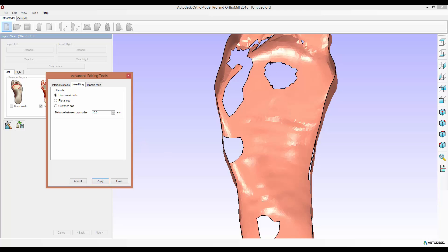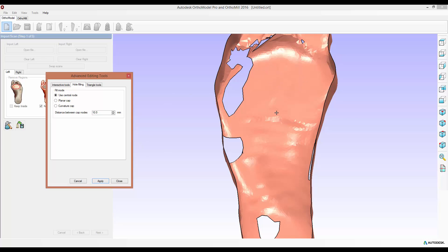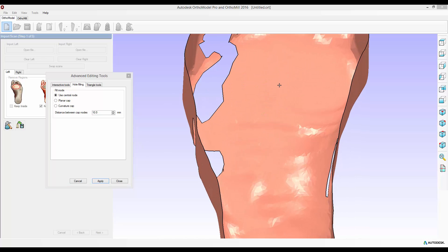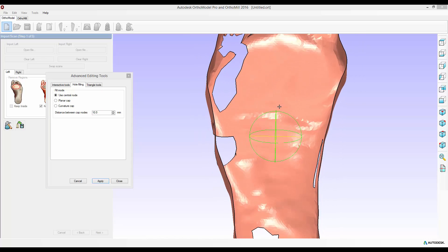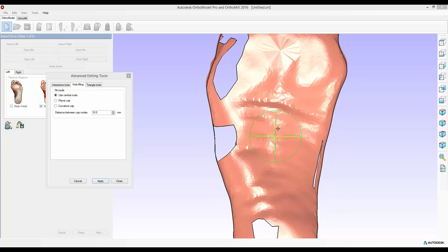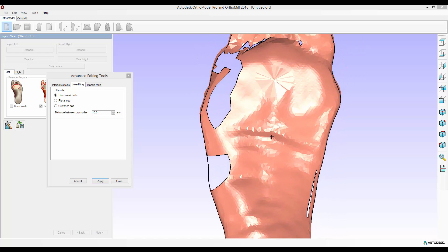Whereas if I use it for something like this larger hole then I may get a few errors. If I rotate the camera to a view which highlights the errors you can see that all of the triangles have been created from the central point which creates a rough sort of surface. It doesn't look smooth at all. This might be good enough depending on your purpose but there are other options better suited to this hole.